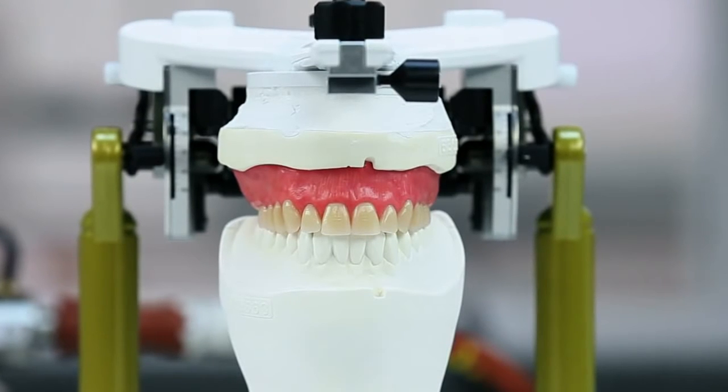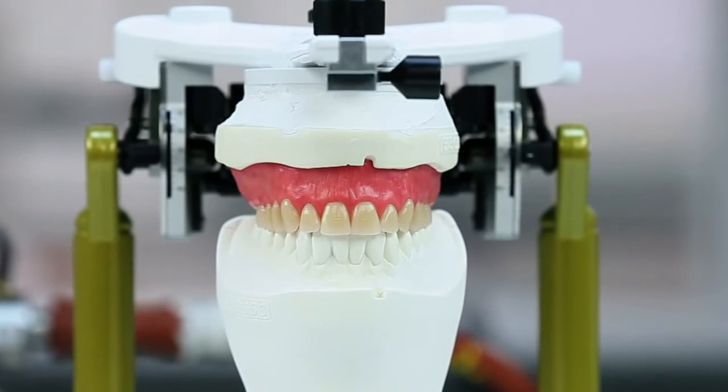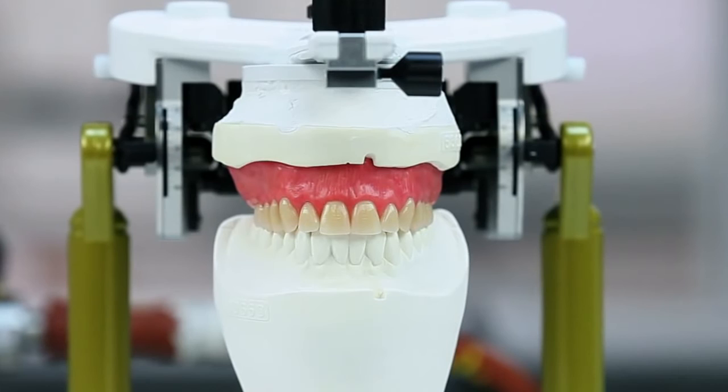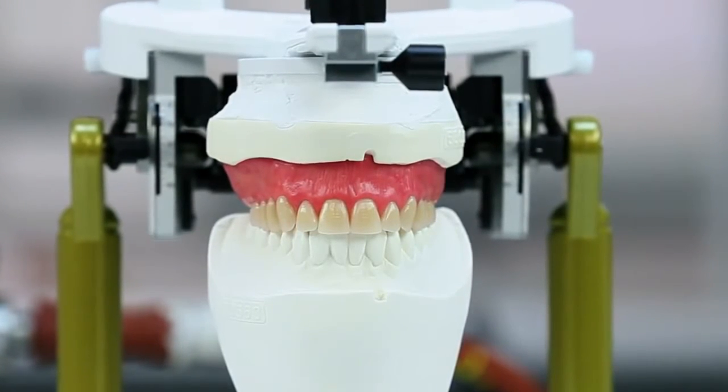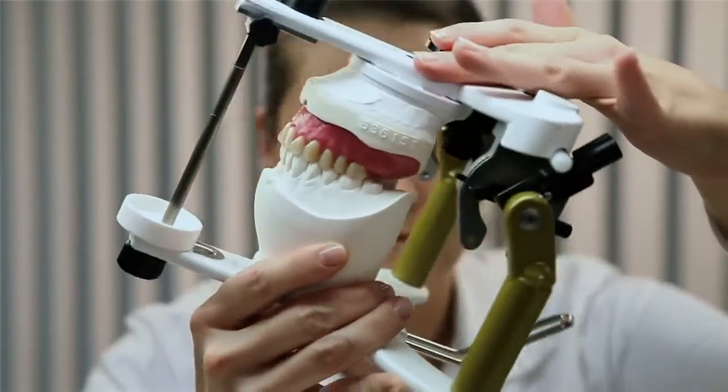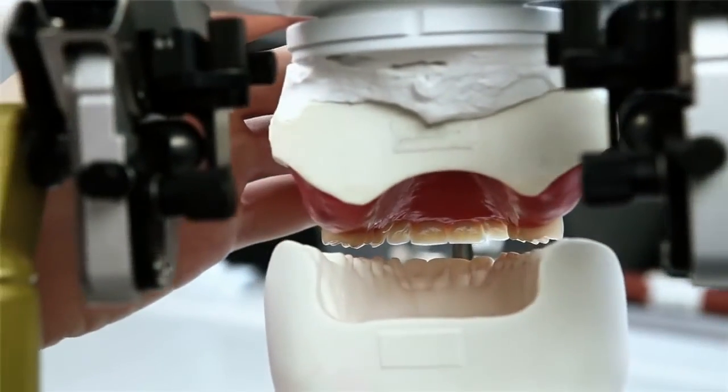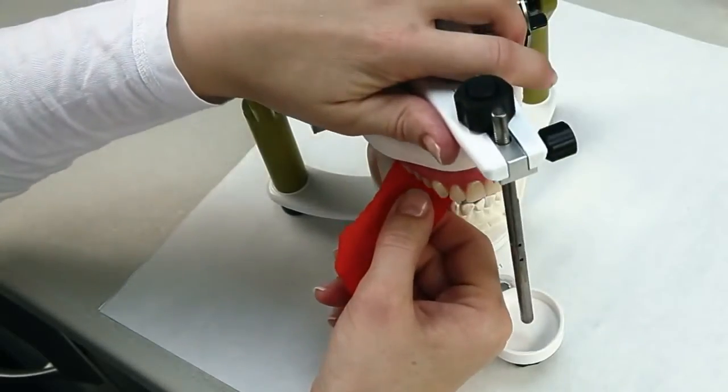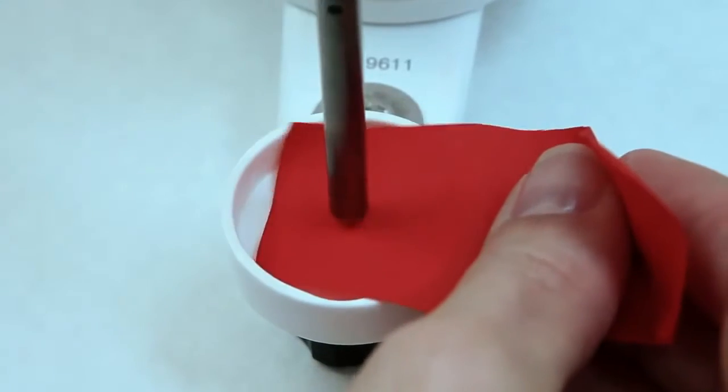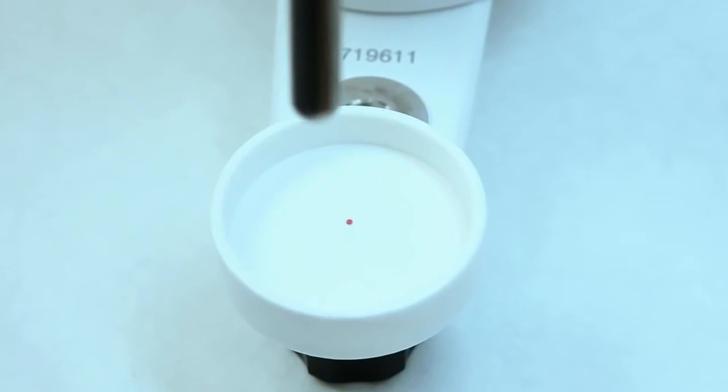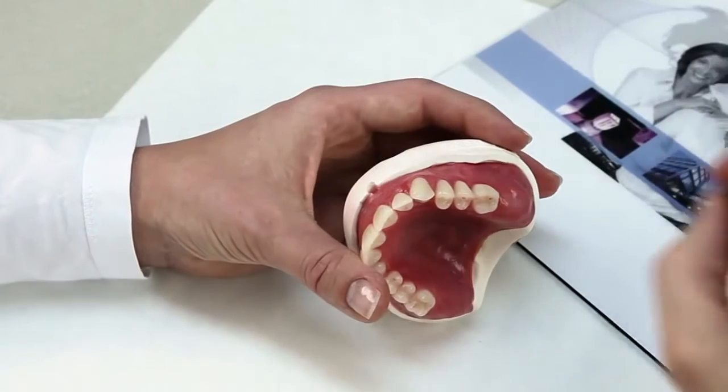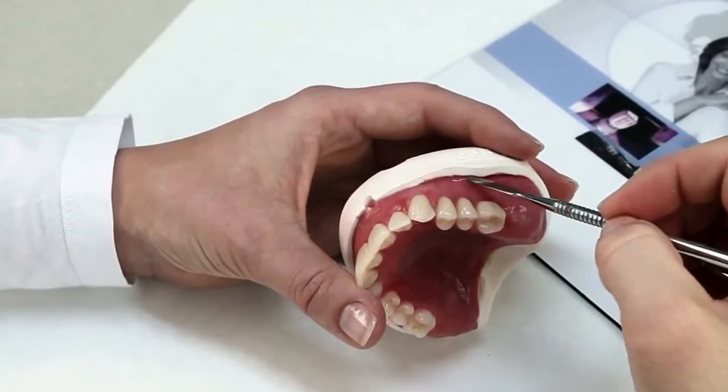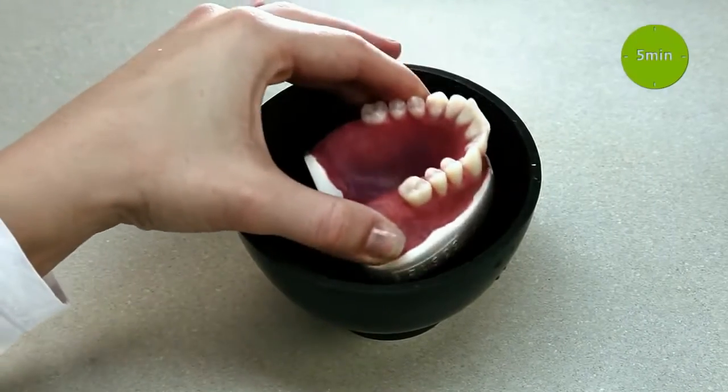The anatomic contouring should correspond with the future completed dentures to as large an extent as possible. This will help you save time during subsequent finishing. Check the wax up in the articulator after try-in. The contact points in the occlusion should already be established at this point. At the same time, the support pin should contact the tray. After that, secure the denture body with wax and store the model in a water bath for 5 minutes.